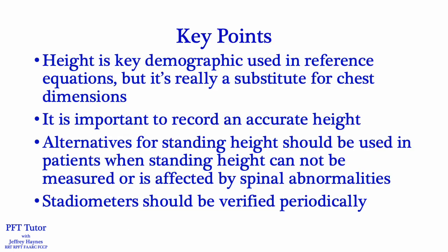Key points: height is a key demographic used in reference equations, but it's really a substitute for chest dimensions. It is very important to record an accurate height prior to pulmonary function testing. Alternatives for standing height should be used in patients when standing height cannot be measured or is affected by spinal abnormalities, and it's very important that stadiometers be verified periodically as part of your quality control program.